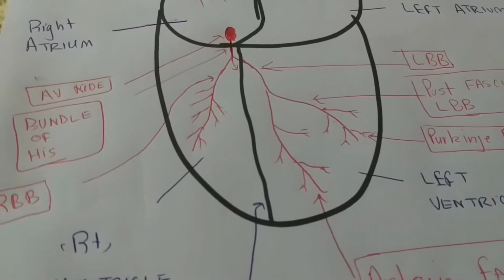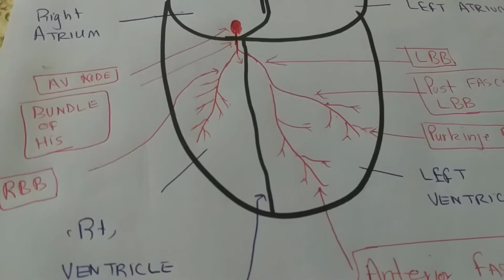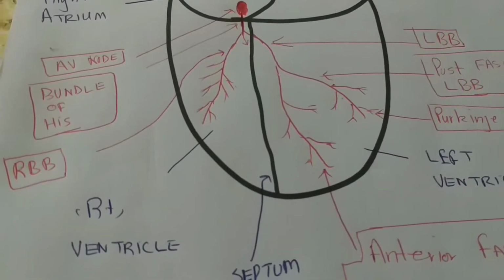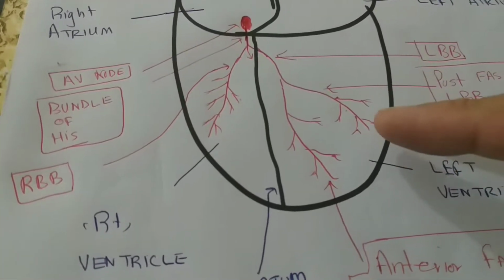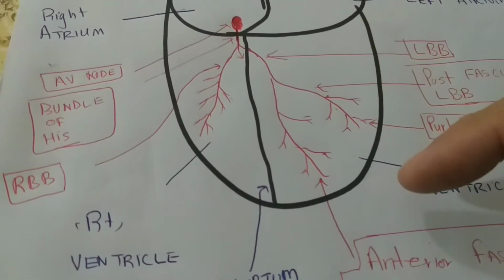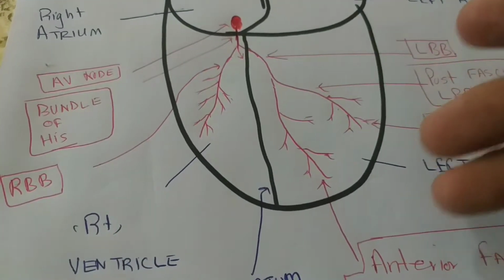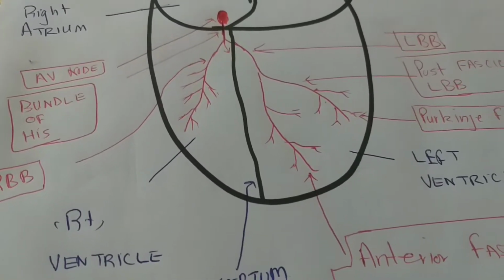The Q wave is formed by the septal depolarization. R is formed by the depolarization of the main ventricular muscles, and the S wave is formed by the phenomenon in which the very same wave of depolarization is going away from the leads before it dies down after striking this fibrous tissue which separates the atria and the ventricles. And then the T wave is generated.